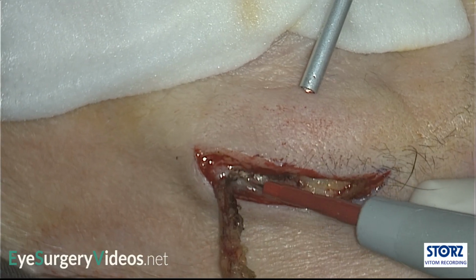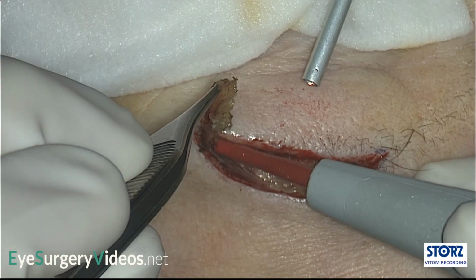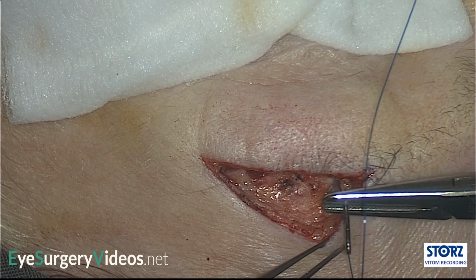While the tissue is being excised, great care is taken not to inadvertently shelve the inferior edge of the incision under the brow, which would excise hair follicles.